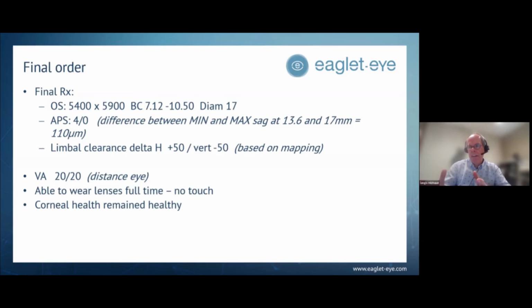She saw a lot of practitioners who did trial and error, like a blind person, not knowing exactly what was going on, certainly not identifying where it matters. In some cases of pterygium, for example, you may create a vaulting just locally over there, but you know exactly where it is. You can not only guess, but you can measure the size and the depth of that surface to vault over, and it's really unique information that can be relayed to the lab to make the best lenses possible for the patient. So in that case, a successful story.